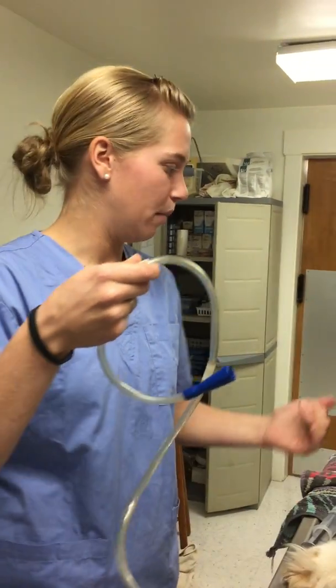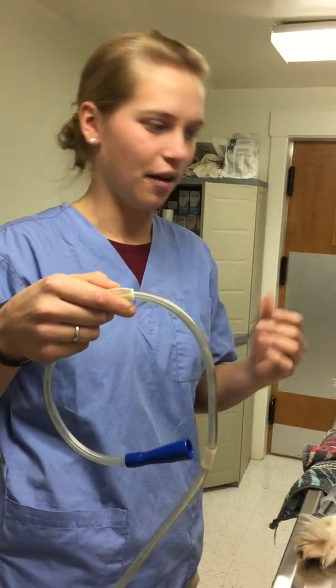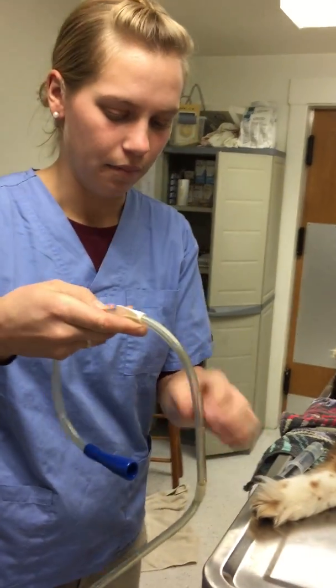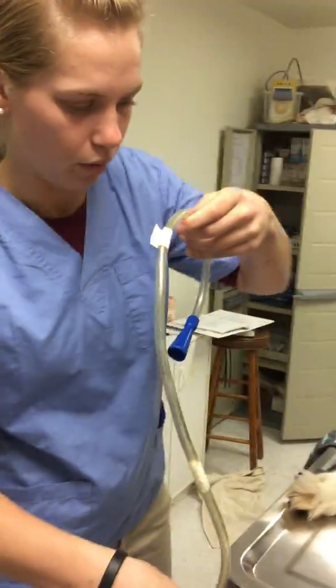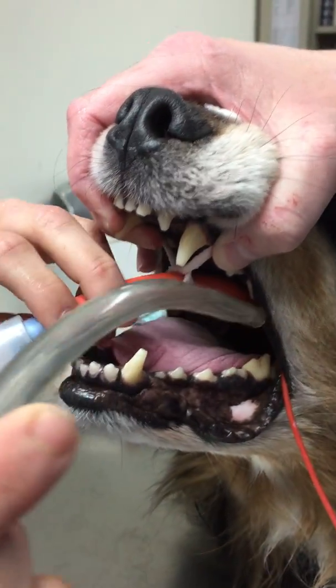We're going to do an oral gastric tube. I already lubed it up and we measured it to the last rib, and the tape here is marked so that we know how far to stick it in. I already have the anesthesia tube in.